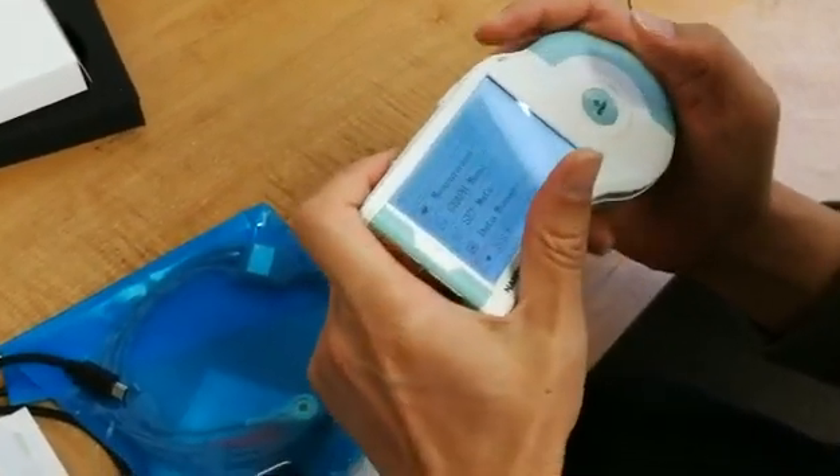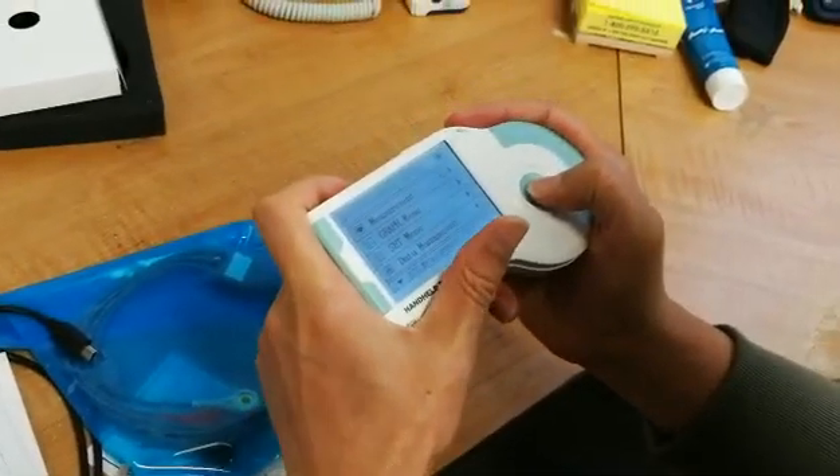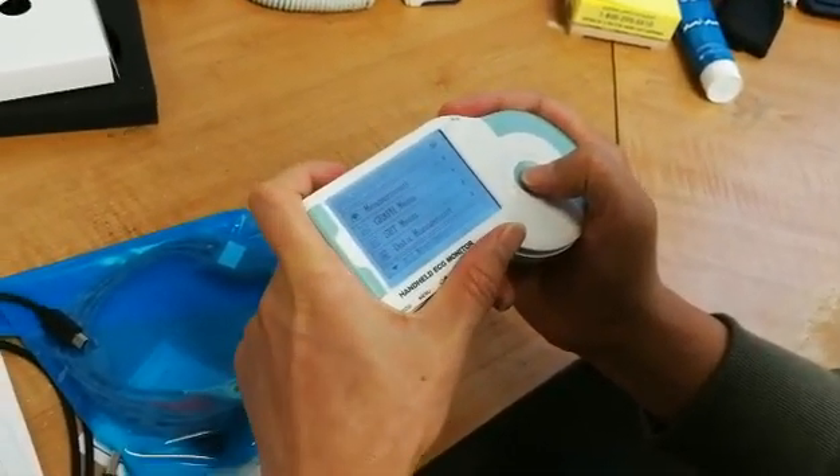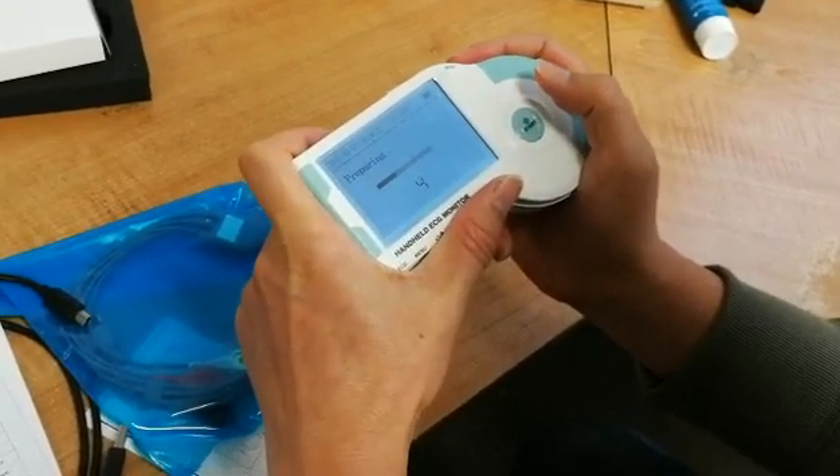Please place your fingers correctly covering both metal sides at the ends. This is very important, as if the sides are not completely covered, it may give an inaccurate reading.